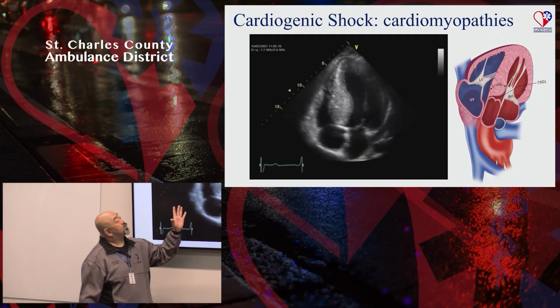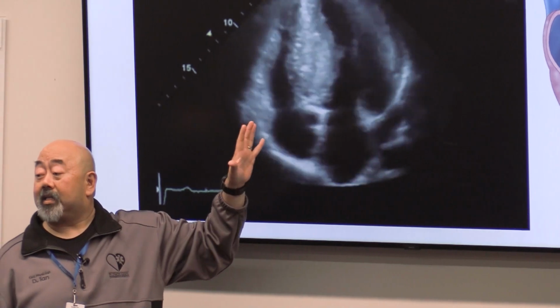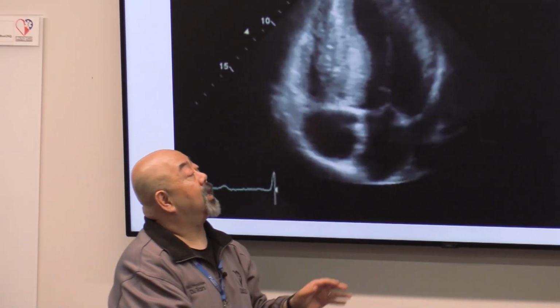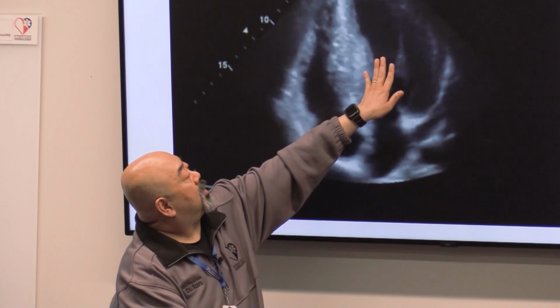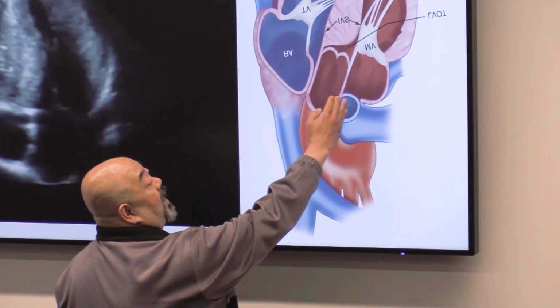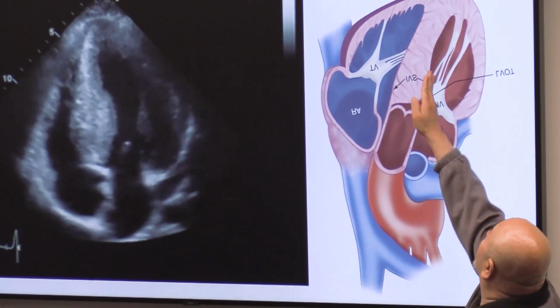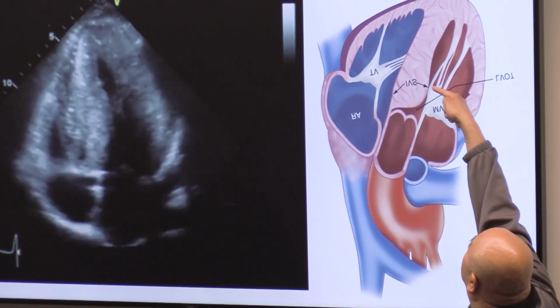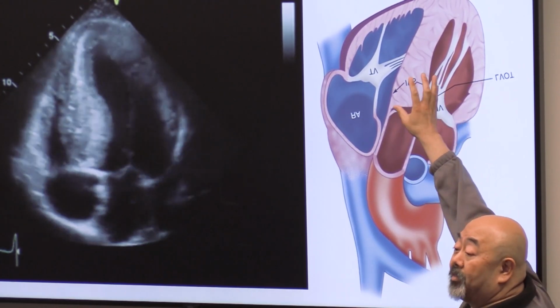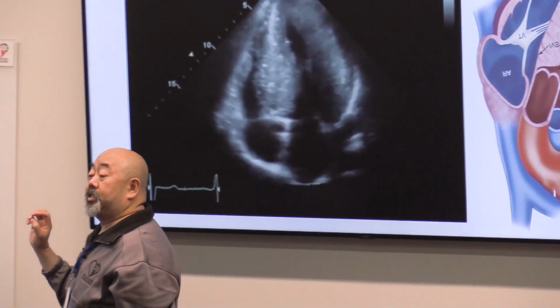But if you look as it's squeezing, here's the interventricular septum we talked about that's so thick that as it squeezes, it's kind of choking its own outflow tract. You can kind of see it here almost where the walls almost touch each other because it's so thick. And you can imagine that as that happens, you can see here that that outflow tract out into the aorta can get pinched off just because of how thick that septum is. And that's kind of what you're seeing here. It's squeezing pretty good. It's just that that interventricular septum is so hypertrophied that it's causing an obstruction.